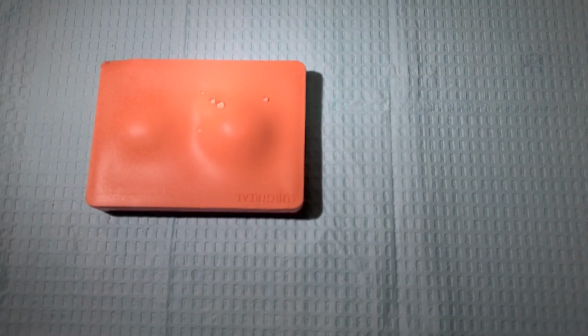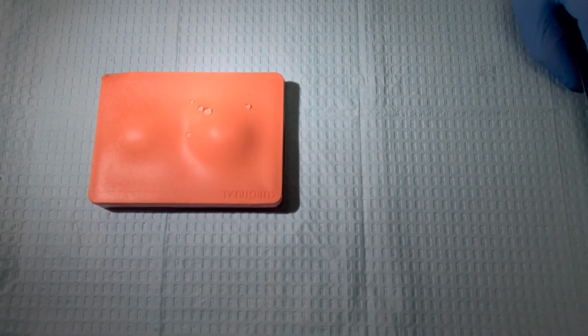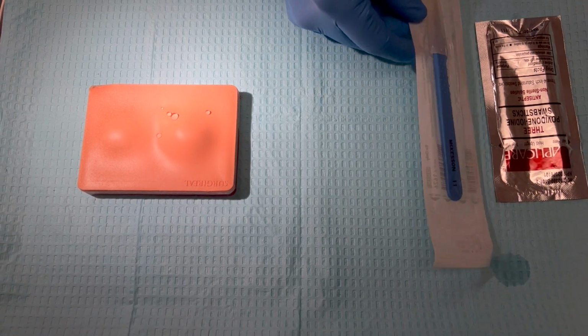Now that we have achieved anesthesia, I'm going to go ahead and set out my equipment necessary for this procedure. I like to line things up in order of use.